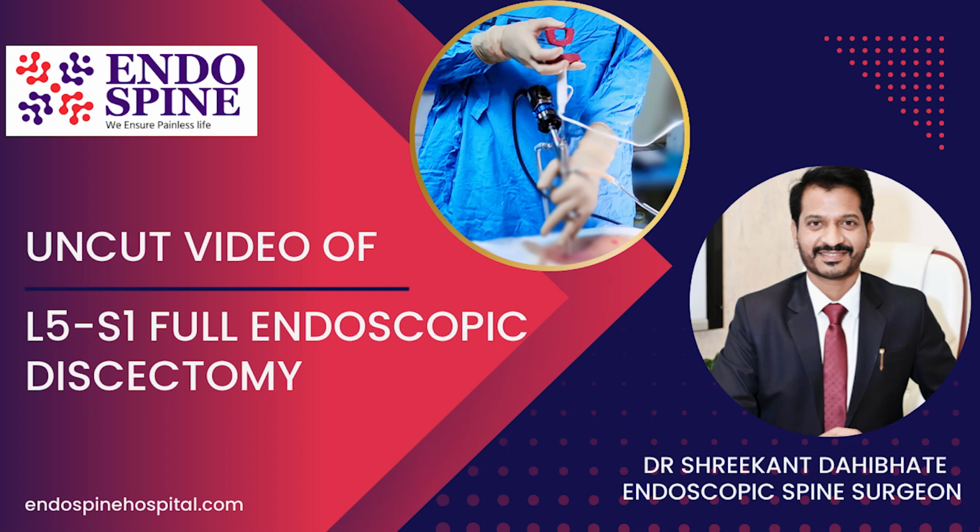Hello friends, so this is the third case of our series of uncut video demonstration of full endoscopic spine surgery. Here today I am going to demonstrate again a very simple case for the beginner. It will be an L5S1 paracentral disc prolapse on the left side. In this case we are going to do interlaminar endoscopy on the left side.